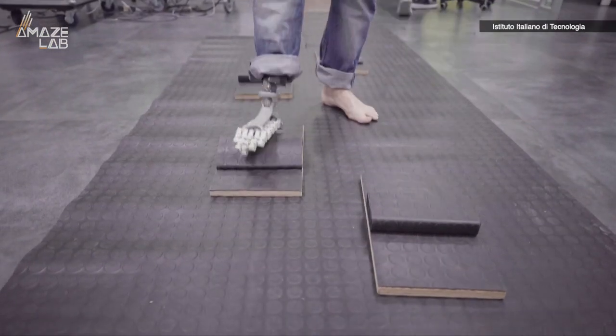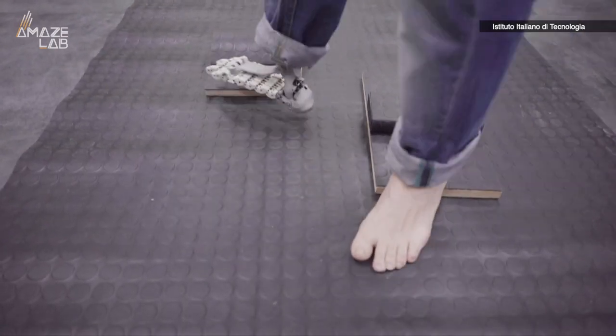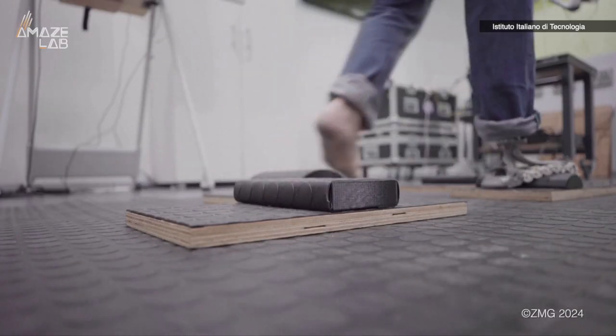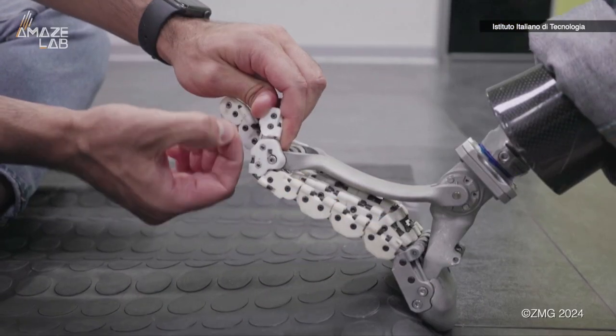Meaning unlike other prosthetics, this one is truly all-terrain — and it could be used for robots as well. Currently, most humanoid robots have flat feet, which improves stability but sacrifices their ability to function on all surfaces. The best part: the Softfoot Pro doesn't have any motors, meaning it doesn't need to be charged.